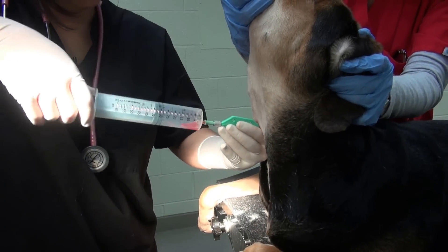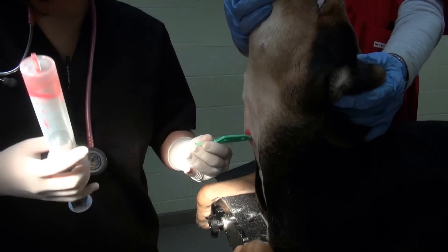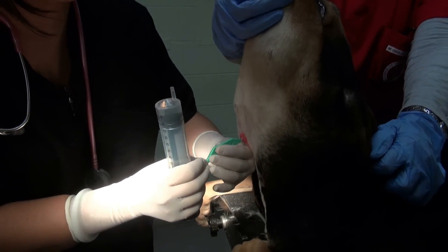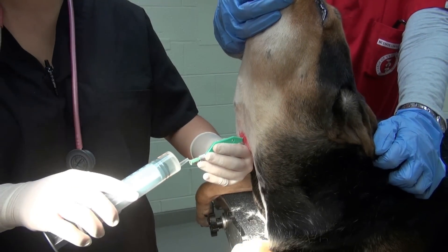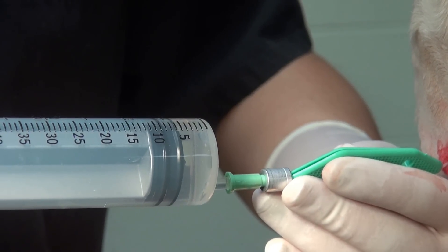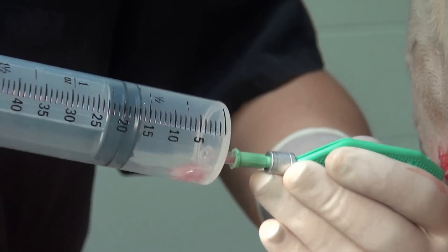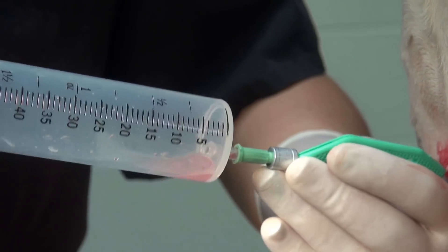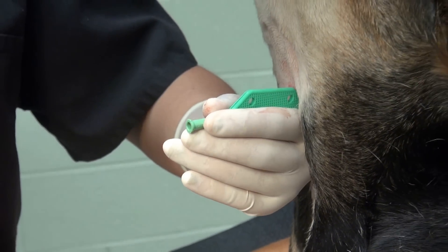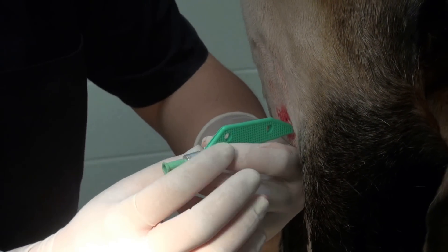Notice that the fluid here is bloody-looking — a consequence of the trauma from the initially misplaced needle. Eject the air from the syringe and then use the same syringe to aspirate again. You can also inject a second 5 ml aliquot of saline and immediately aspirate again. Getting blood-tinged fluid and air back in the sample confirms we are in the airway — we're aspirating from the lumen of the trachea.